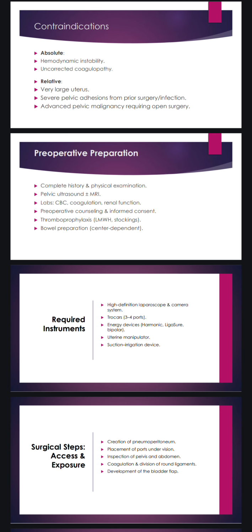This procedure has absolute and relative contraindications. Absolute contraindications include hemodynamic instability or uncorrected coagulopathy, and relative contraindications include very large uterus and severe pelvic adhesion from previous surgeries or infection, and advanced malignancies that require open surgery.